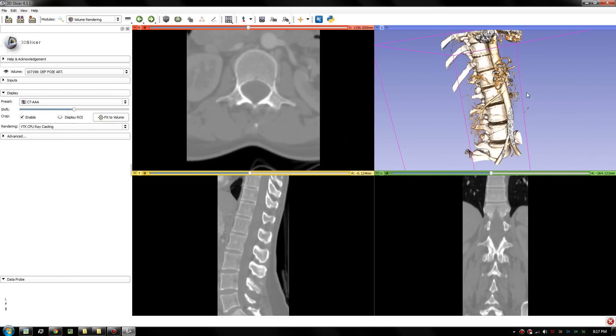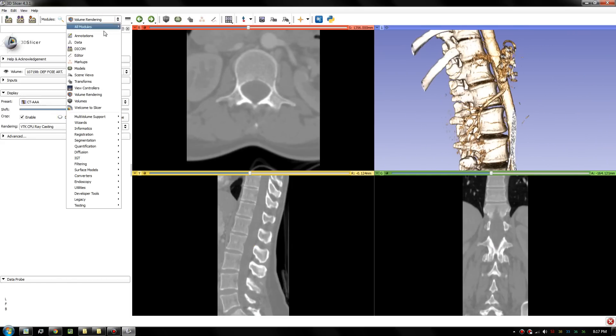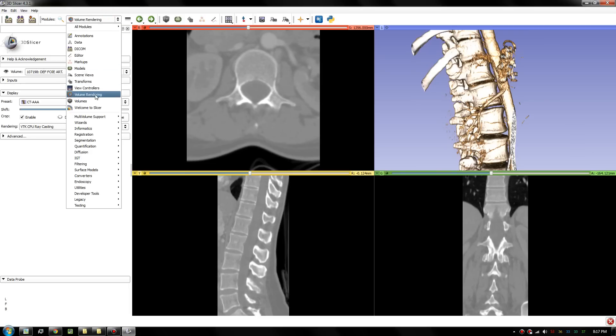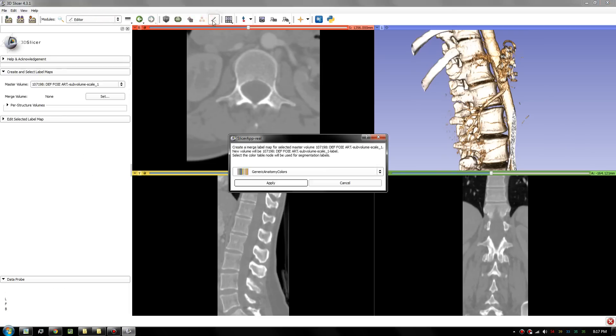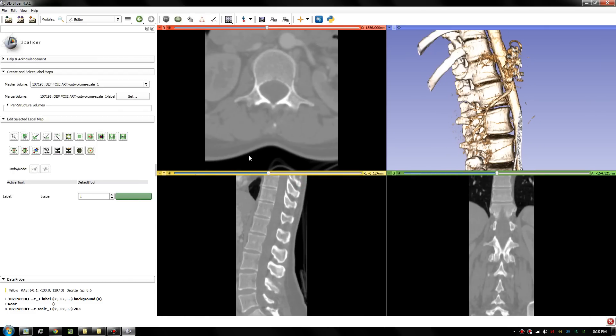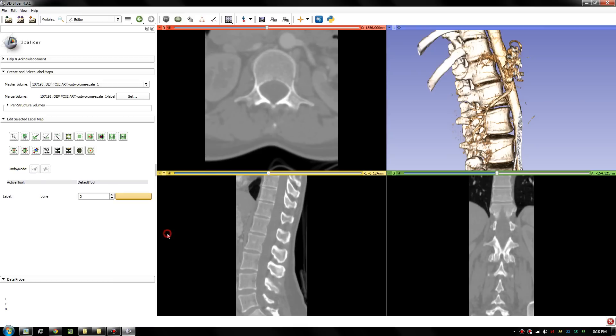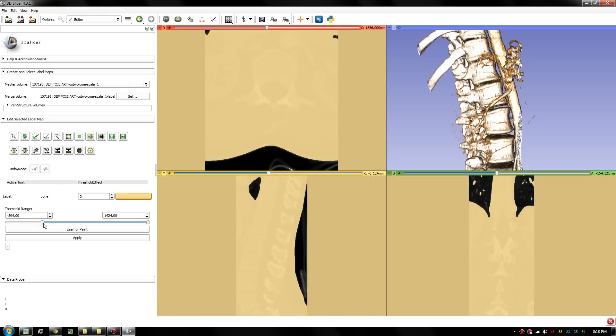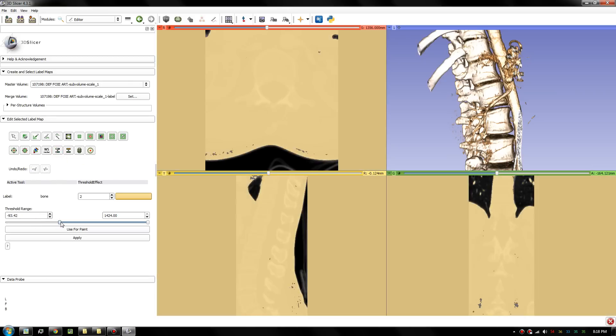Once we have this selection to generate a 3D model, we will go to edit here. Go to the editor or select the editor in here. So let's apply that. Within the editor, we can assign a color for certain things. Assign the bone color. There's a range of selection tools, but there's this tool which is based on the threshold. When we do that, we can drag this slider.